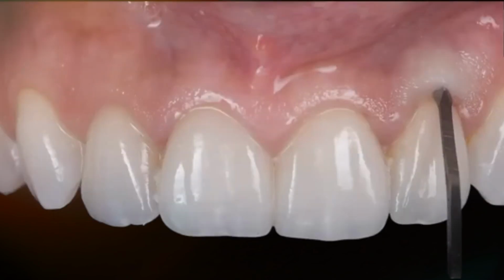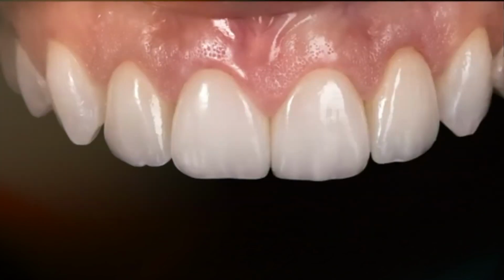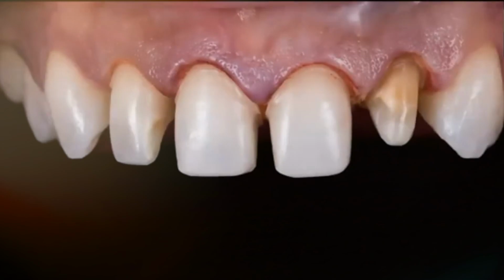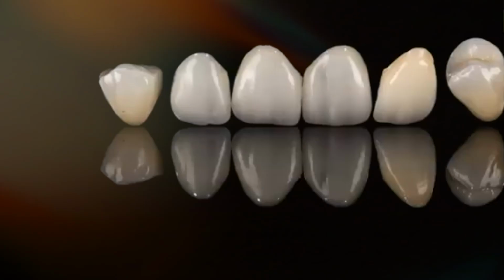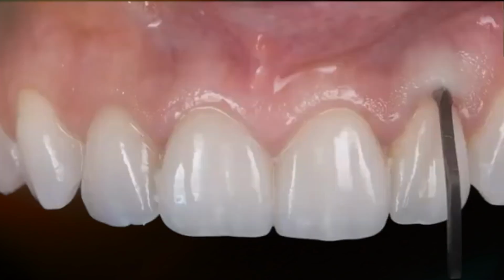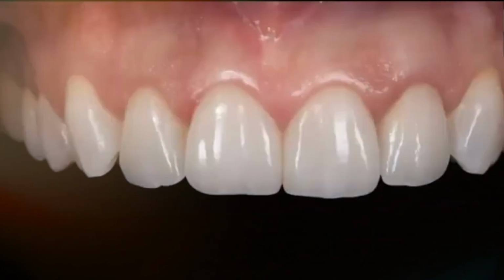So in this case, we stain, and also you can see here, the critical area in this type of cases is at the margin level. The margin here, you want to place it subgingivally, and then also think about augmenting the tissue a little bit. Otherwise, you're always going to have like a gray halo. So we bond the stained restoration, we augment with a soft tissue graft, and then this is the result at the end, and this is in polarized light.